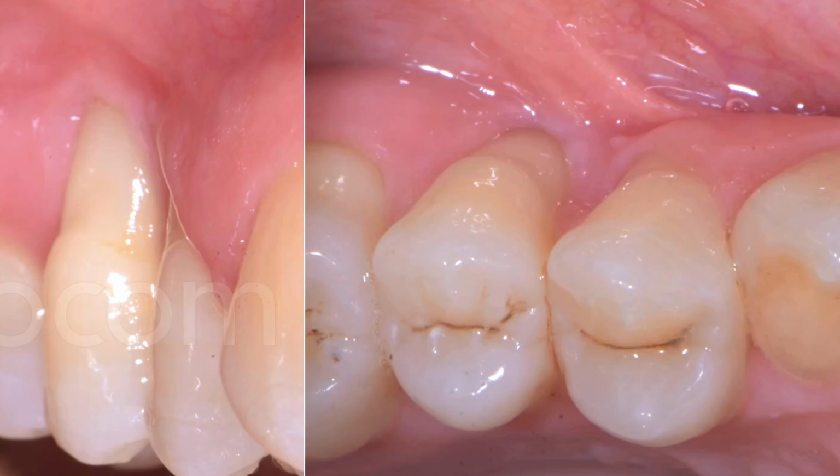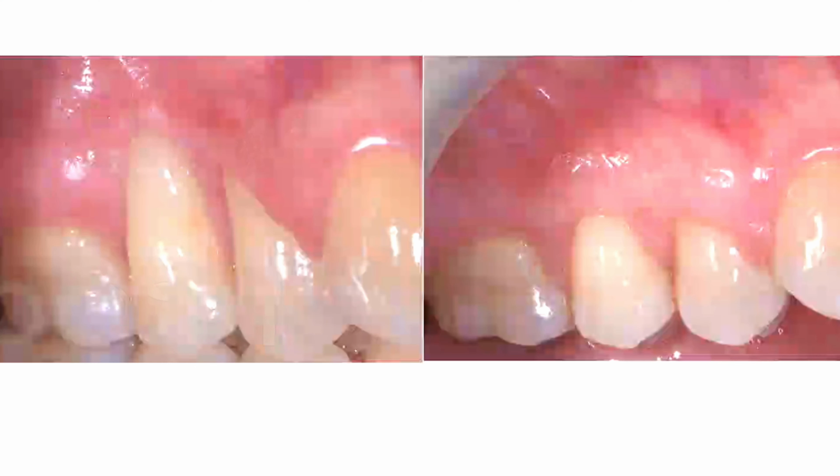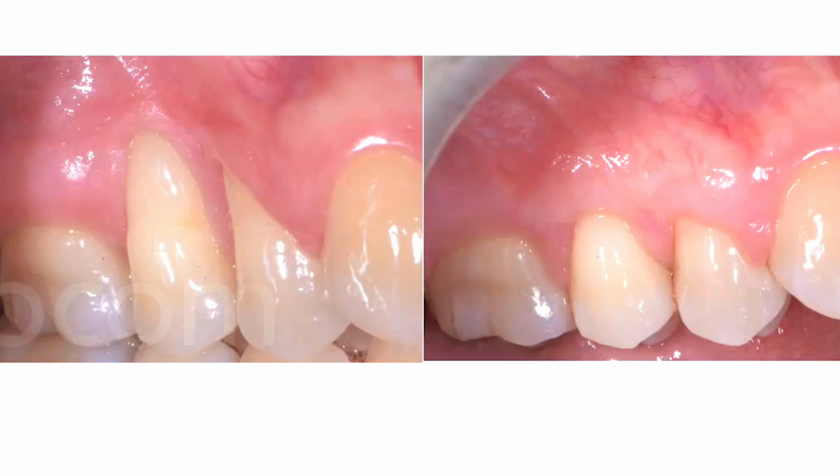So what can you do in a case like this to surgically compensate as much as possible the proximity between the roots? This is the best. If you try to reduce this, you go to the pulp before there is a significant increase in the vascular bed, you know?